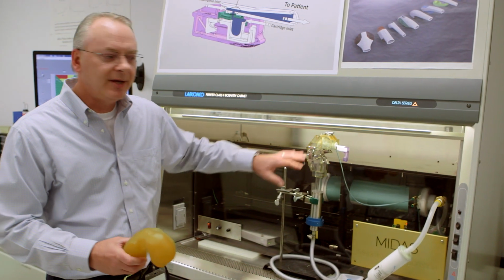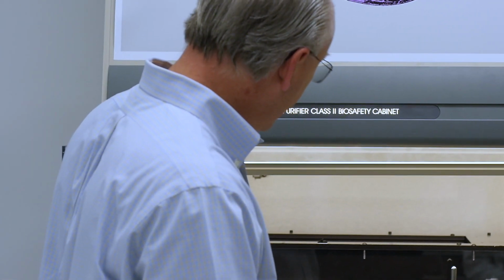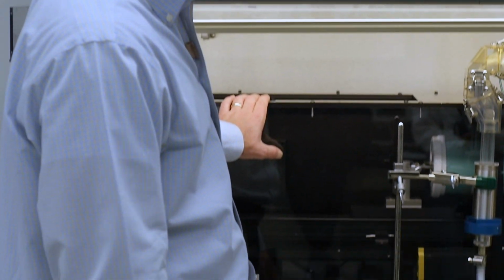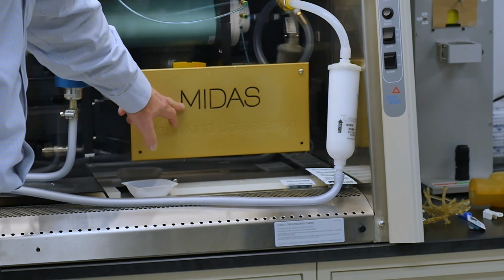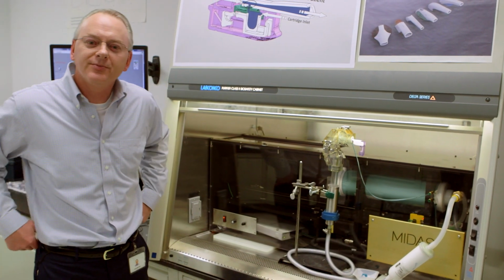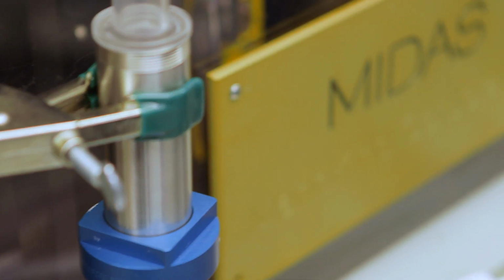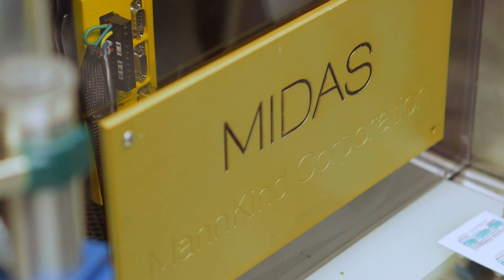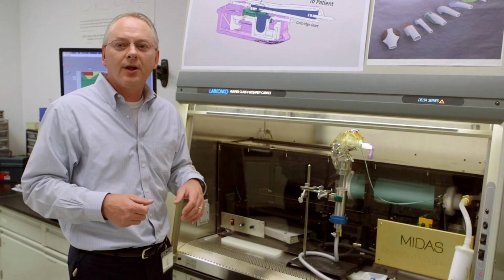So we take the anatomy that we have from Ben and we link it to a piece of physiology in the background here. This big black box is called MIDAS, Mankind Inhalation Data Automated Simulator. Put a gold plate on it because we're engineers and we get a little geeky at times. But in MIDAS is a syringe pump. You see the green syringe pump here. And what it does is it pulls prescribed inhalation efforts. We can create pressure just like a human lung can.